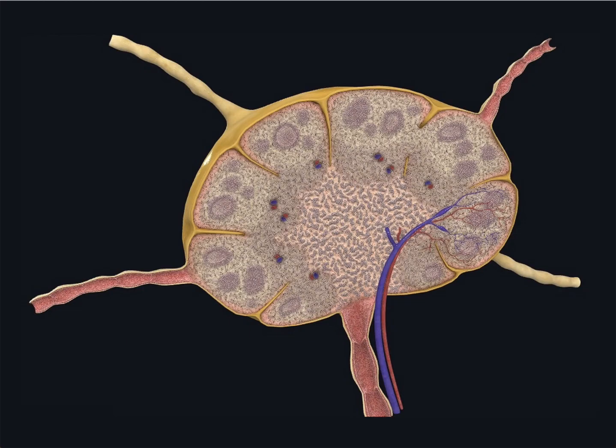Now refer to this model of the lymph node to understand its general architecture before I then show you histological images of the pertinent components that I will mention here. Lymphocytes and lymph enter a lymph node via afferent lymphatic channels into a subcapsular sinus and then a trabecular sinus, and then into medullary sinuses, and so percolate through the substance of the lymph node.